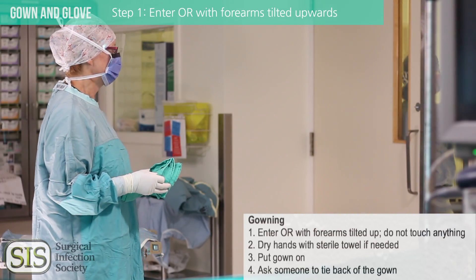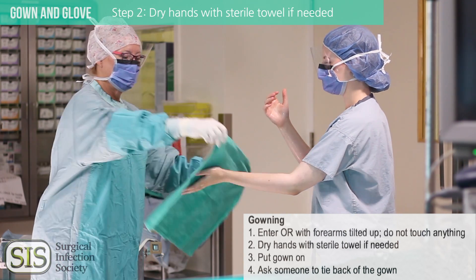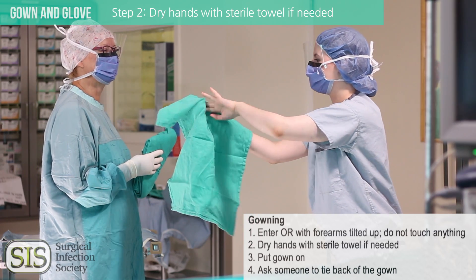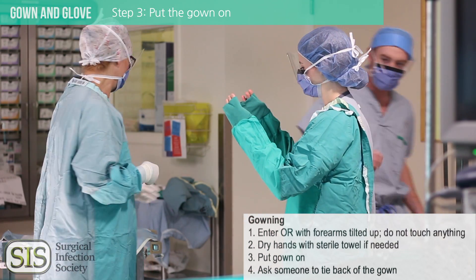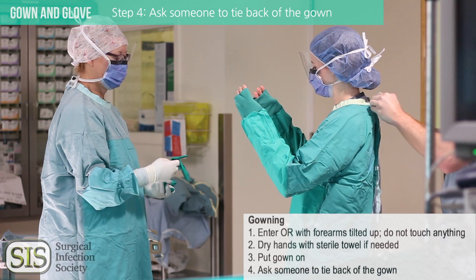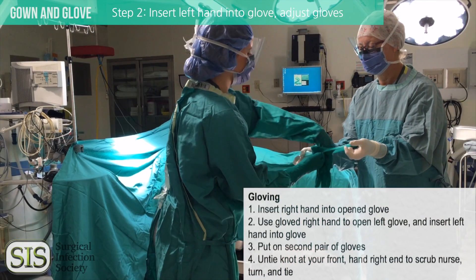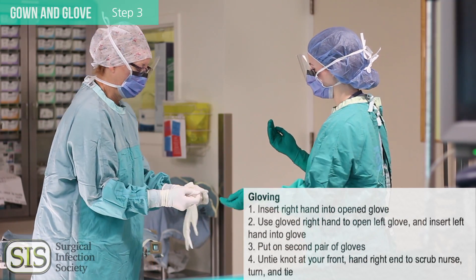Wait for the scrub nurse to assist you. If you've used a water-based scrub, ask for a sterile towel to dry the hands off. Place your first hand underneath one side of the towel and use it to wipe your opposite hand and arm. Hold your arms out and put them into the sleeves of the gown. Shrug your arms into the gown until your hands are down to the ends of the sleeves. An unsterile member of the team will tie the back of your gown — because remember, this is unsterile. Insert the right hand into the open surgical glove, then use the right hand to open the left glove. You can now pull up the sleeves of your gown so they are not bunched up in your gloves, then put on your second pair of gloves.